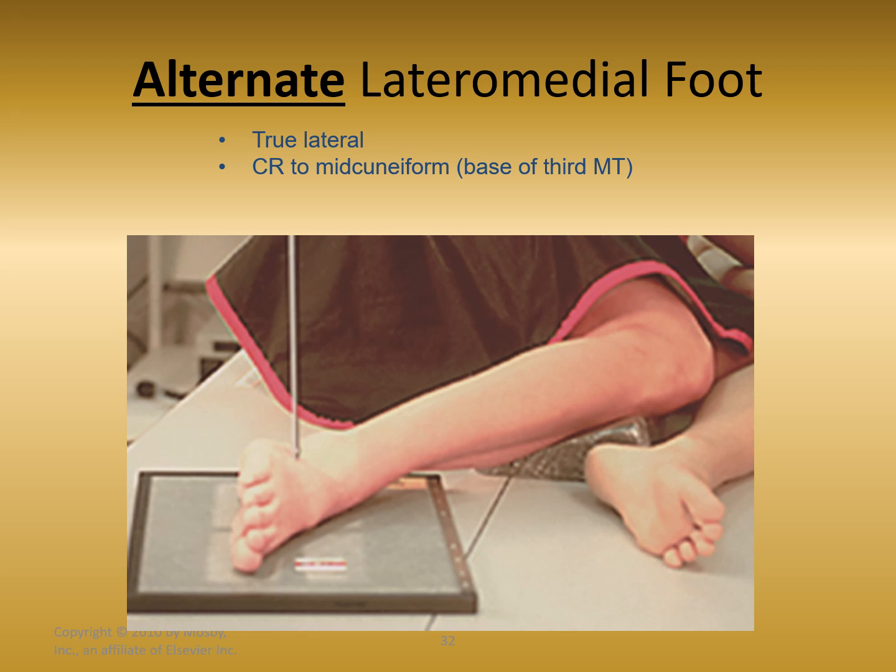is when the patient's condition is such that you can't place the lateral side of their foot on the IR and do the medial lateral projection. It will still give you the same x-ray as a lateral foot x-ray with a medial lateral projection. It will be the same exact x-ray with the same exact criteria. The only change is that maybe your patient could not rotate their leg out and you had to do it with the lateral medial projection instead of the medial lateral.